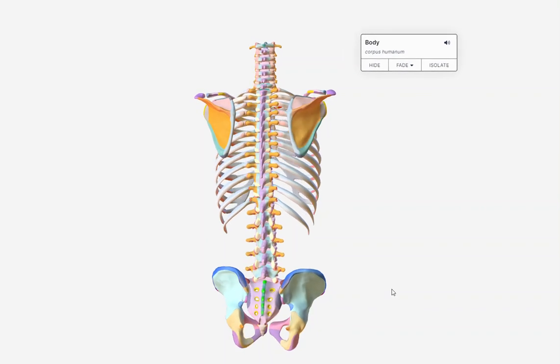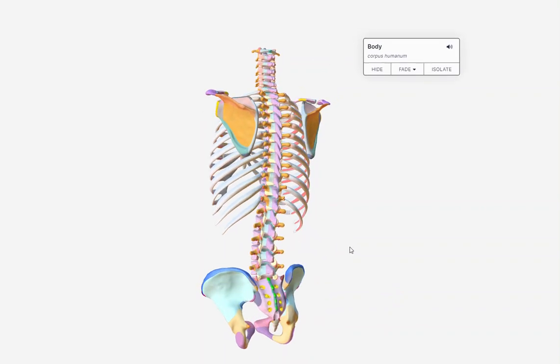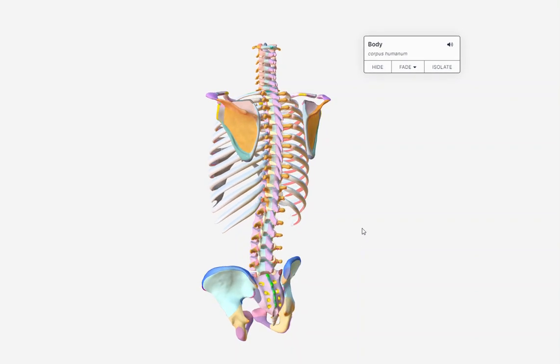Rotate them back. PA projection, rotating the patient. This is their right side, rotating the right side towards the IR. Right anterior oblique, RAO. Look what happened. Left ribs are elongated. This is how it's going to look on our x-rays. Left ribs elongated, left ilium elongated.